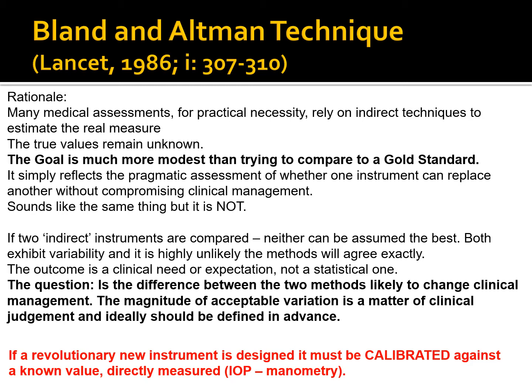So if two indirect instruments are compared, neither can be assumed to be the best. Both exhibit variability, and it is highly unlikely the methods will agree. The outcome is a clinical need or expectation, not a statistical one. So the question is, is the difference between the two methods likely to change clinical management? The magnitude of acceptable variation is a matter of clinical judgment, and the authors do stress this, that it should ideally be defined in advance.